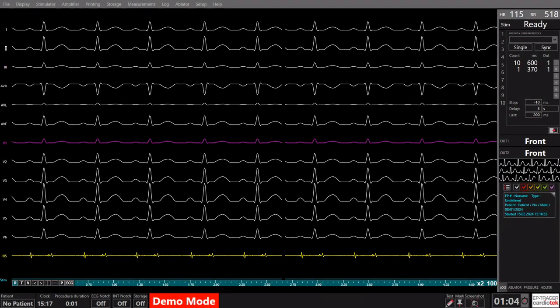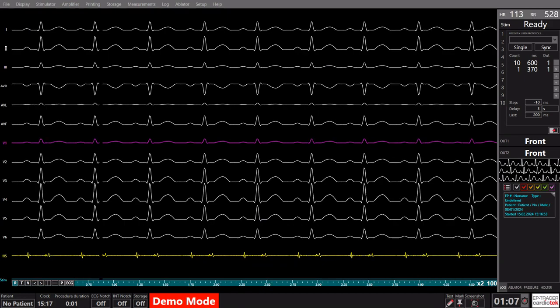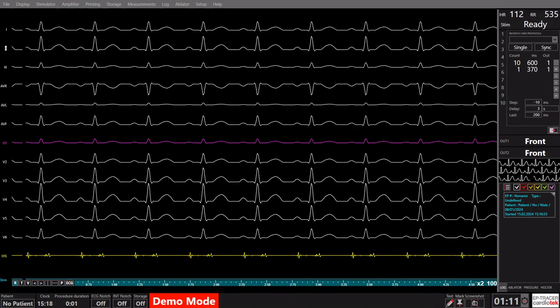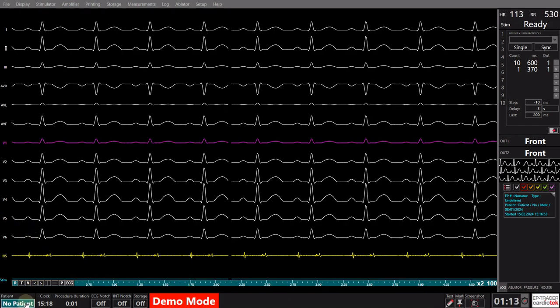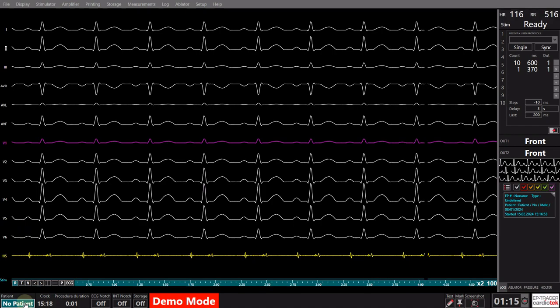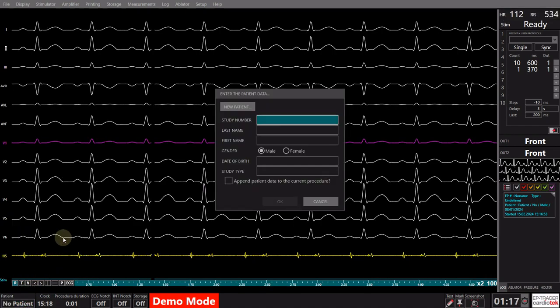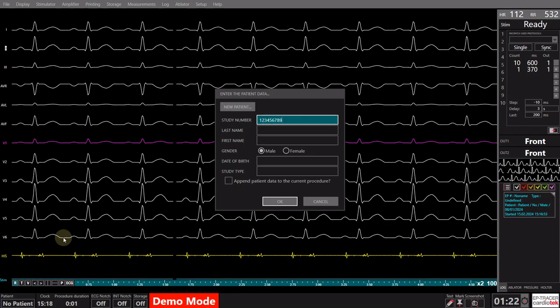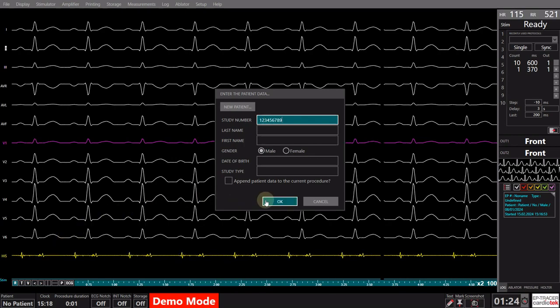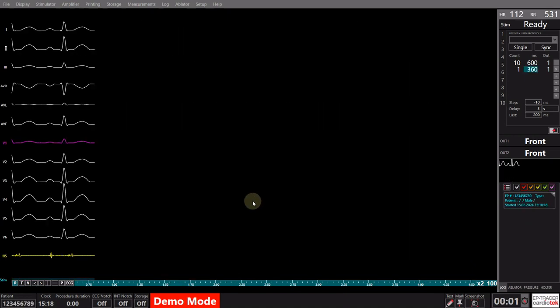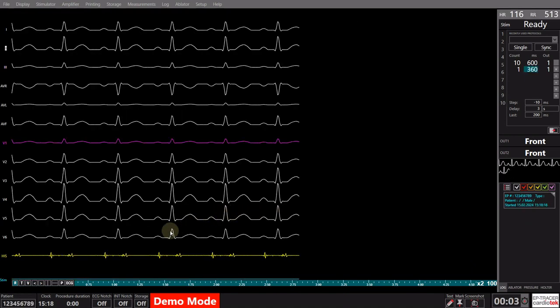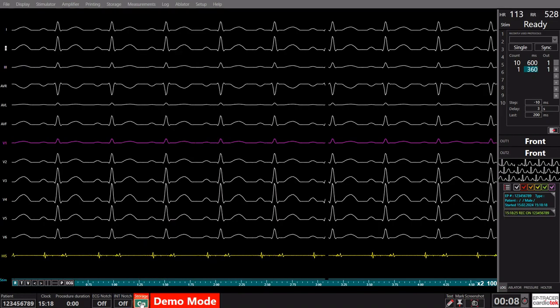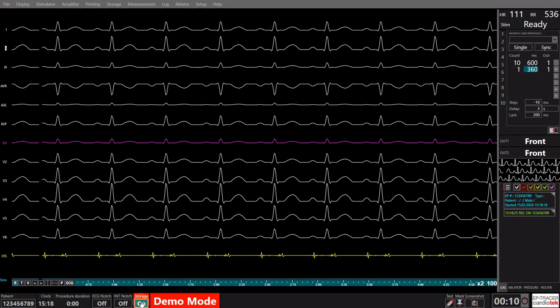Before the intervention starts, it is crucial to input the patient data for comprehensive intervention documentation. Click on the no patient button to enter relevant details. If anonymity is preferred, simply input a unique identifier for the study number. As the intervention commences, initiate the recording process by either clicking the storage button on the screen, or pressing the letter on the keyboard.